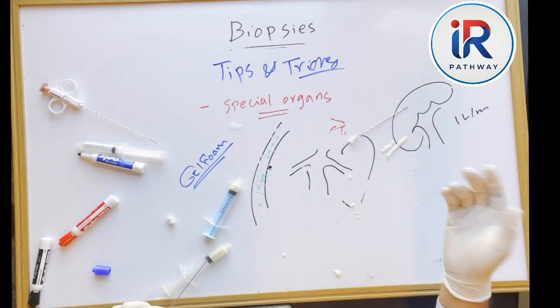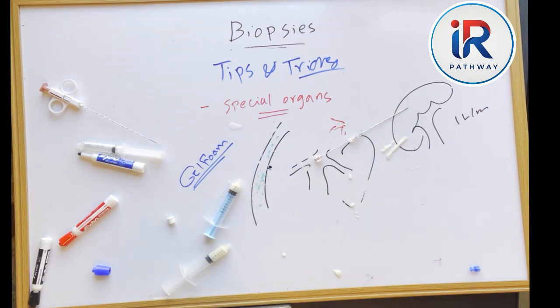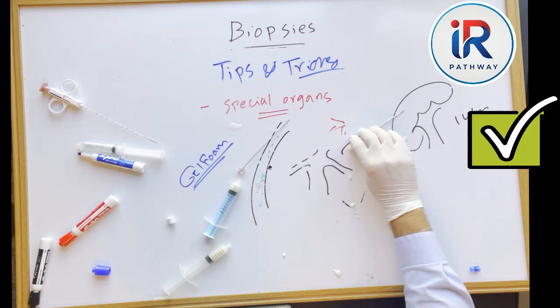Again, if you have no other options and the blood is seen through the needle, you can use this technique as a hemostatic agent. Now, after everything we have been through, if you notice, many complications occur after you have already taken the sample and left the needle like this.